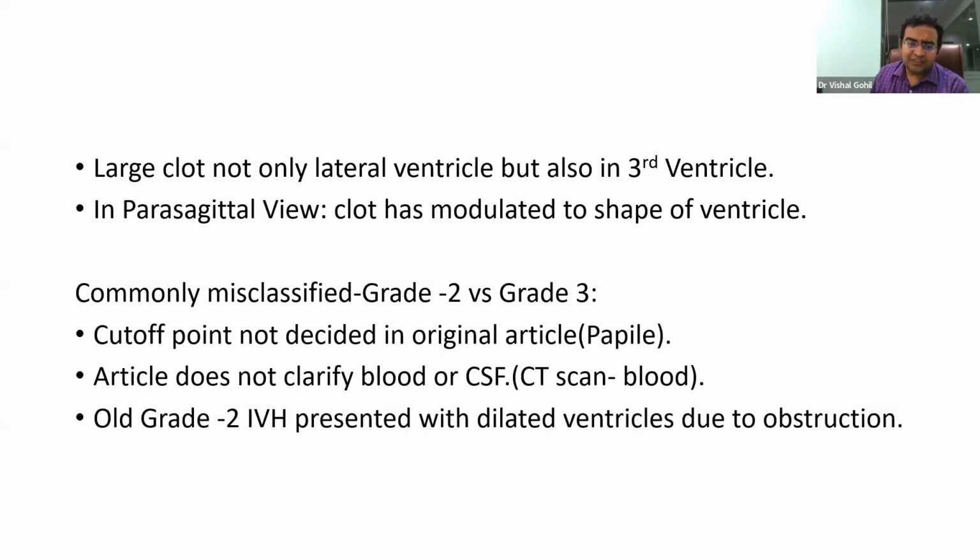This is the commonest mistake, not mistake, but the commonest finding of the radiologist. For example, in our unit, sometimes the baby has a normal head ultrasound at day 4. And after that, we ask for an ultrasound after 2 weeks. When radiologists come and see whether there is a ventricular dilatation or not, they mention there is a ventricular dilatation and that it is grade 3. But we don't know whether the dilatation is because of the CSF or because of the blood.